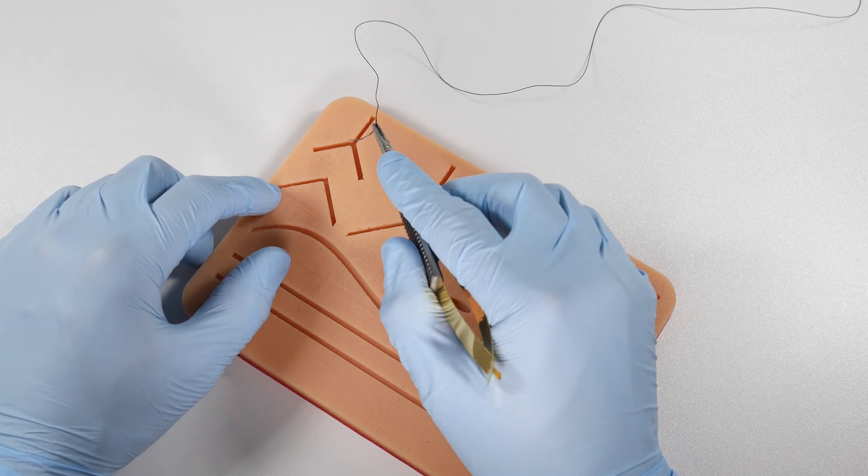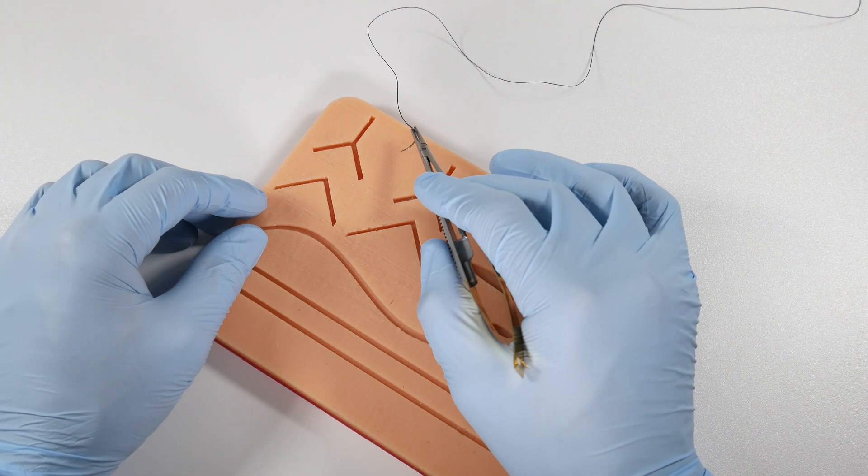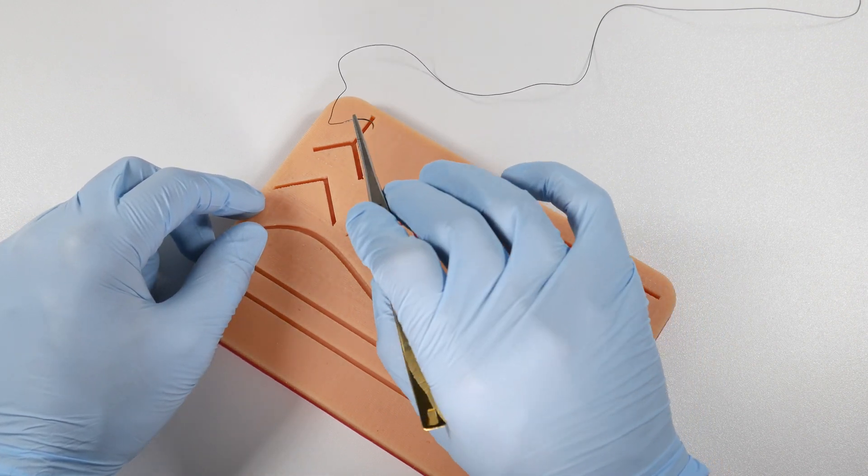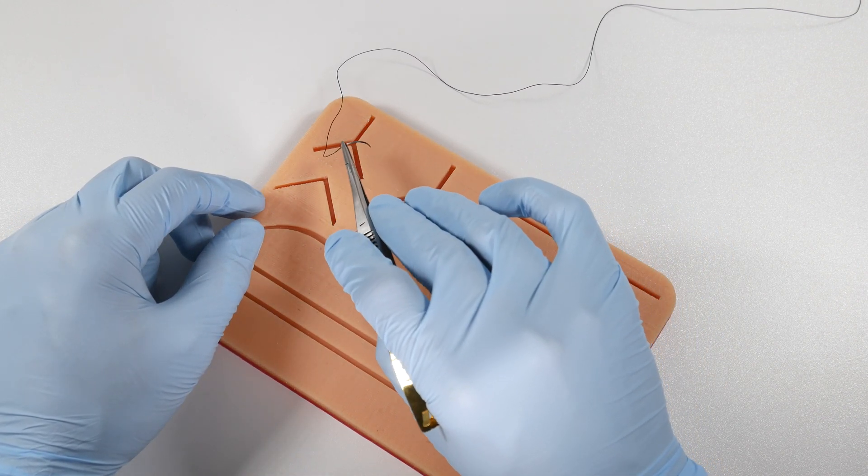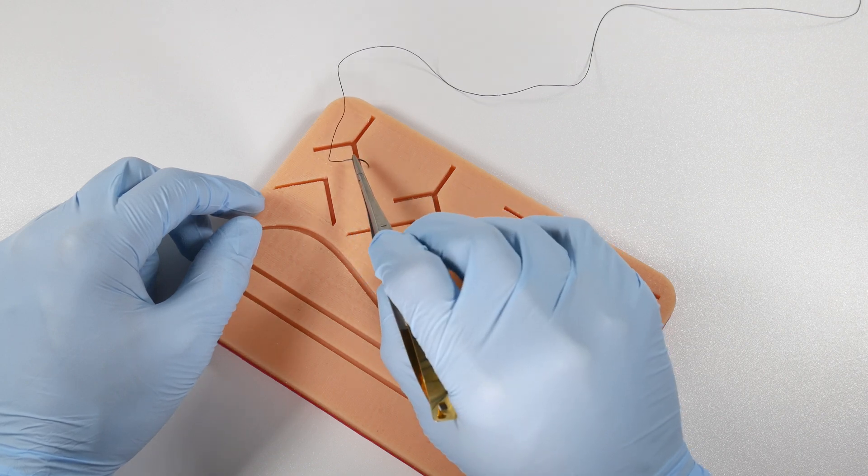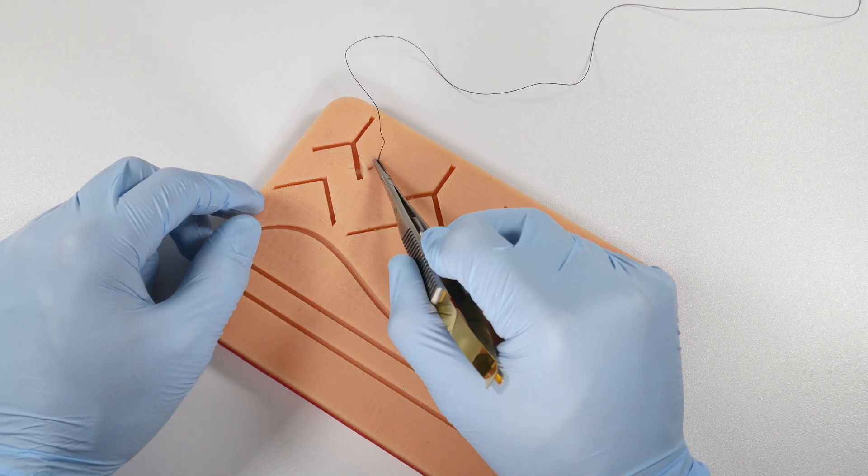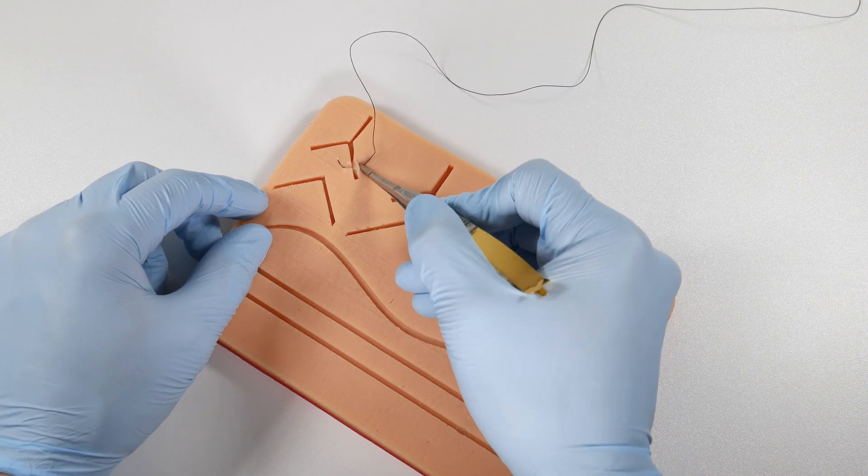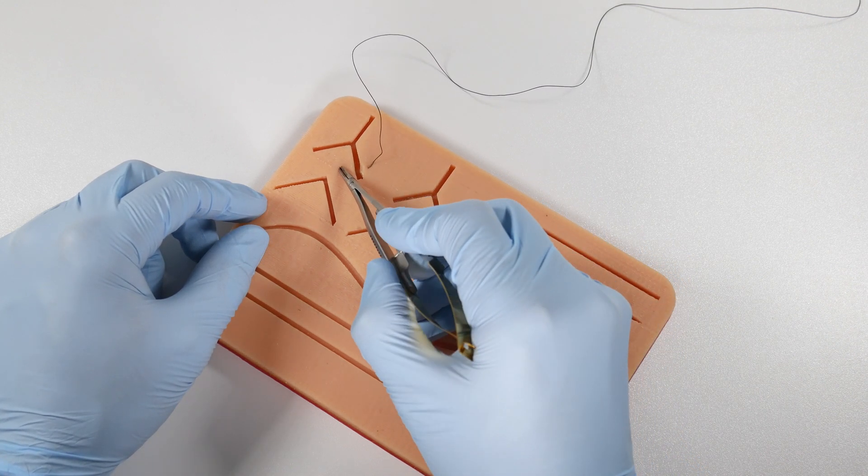You can get an entire bite back there through the tissue, maybe easier than you would with your traditional needle driver. You can go right up here to get that 90-degree entry point into the tissue, which is important. Roll it through and you're going to come out the other side with pretty good accuracy, which again is fairly desirable when you're suturing.